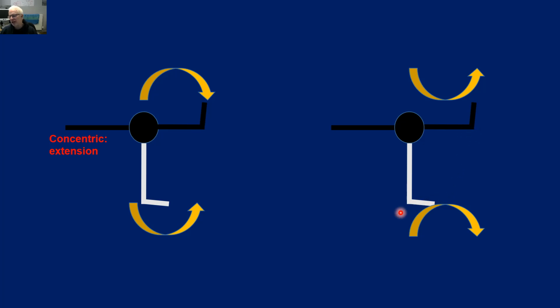And we've got a preset target of say 60 degrees per second, so the dynamometer will start to move. What is going to happen is that in this example, the participant is actually trying to prevent the limb from accelerating. They're trying to prevent it from moving through this range of motion. So they're pulling back against the dynamometer arm. The dynamometer is trying to pull in the opposite direction. It's trying to accelerate. So here, we're decelerating or trying to apply deceleration, therefore it is eccentric extension.